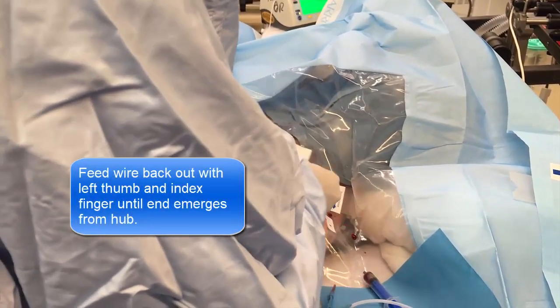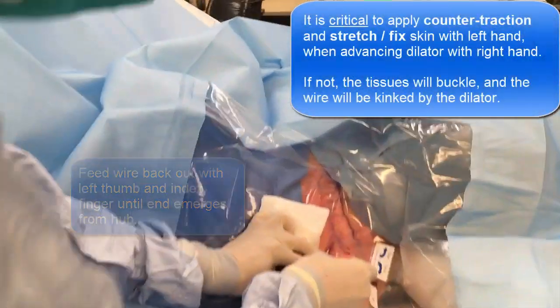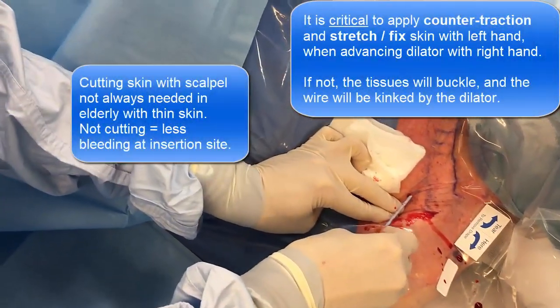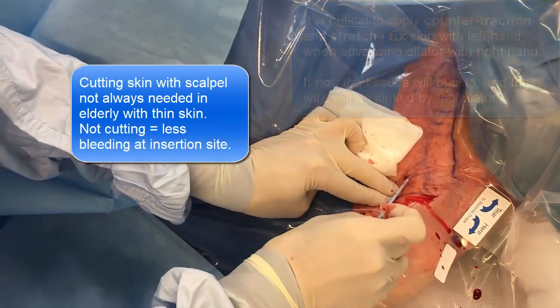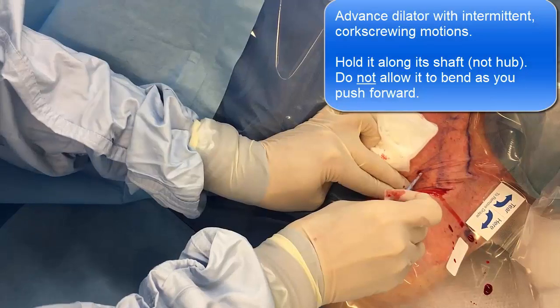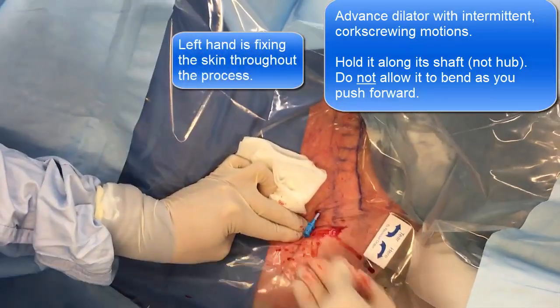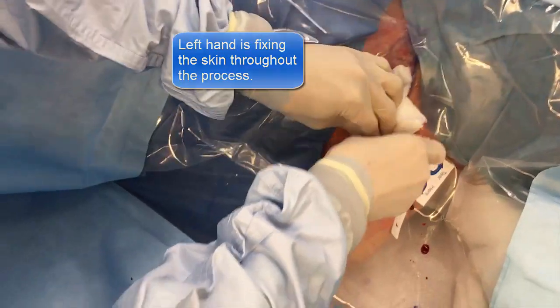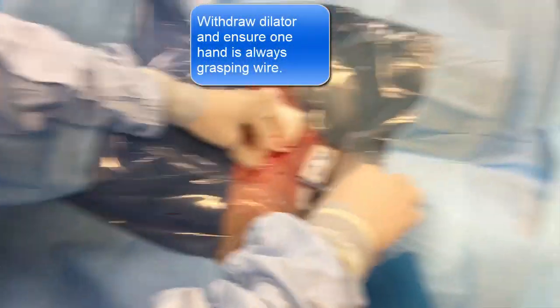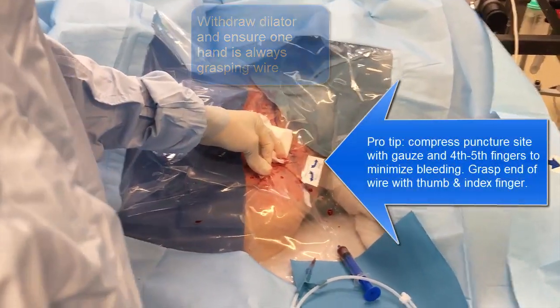See how I stretch the skin — I'm actually not going to cut his skin because he's got such loose skin. But remember we were talking about stretching: see how I counter-traction and then I push this. All the time they've got a wire in. That's what the counter traction is — that's what I was talking about in the lounge.